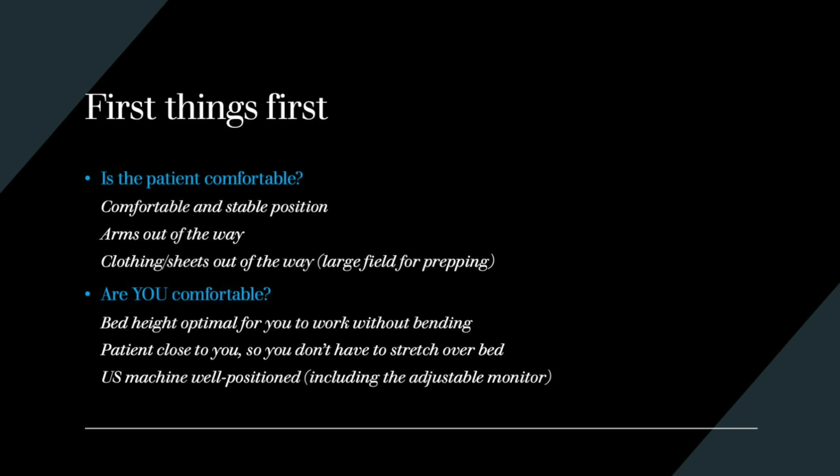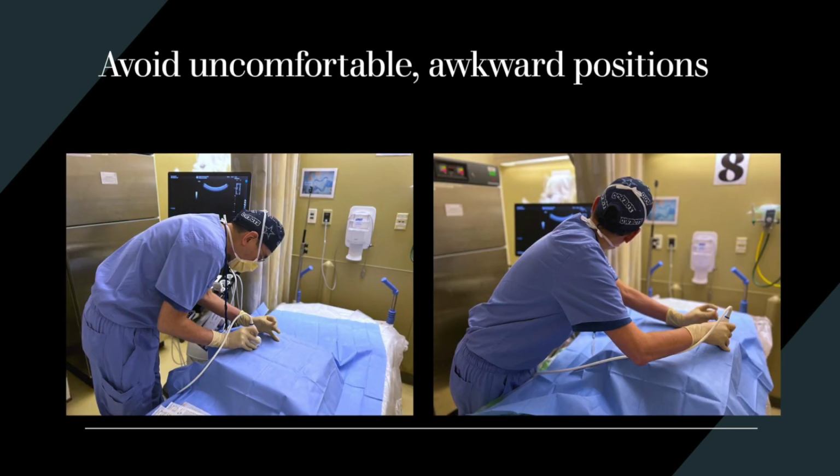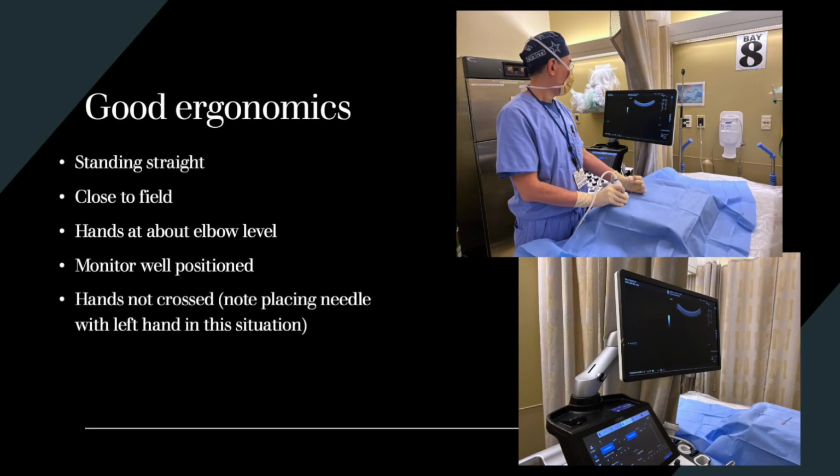Then you should ask yourself, are you comfortable? Make sure you have the bed height where the procedure is being done optimized for your height so that you can work without bending too much or without stretching yourself too much. So this is an example of a procedure being done where Paul here is definitely not very comfortable. You can see how he's bending down to be able to access the area where he's going to be performing this biopsy. And in the other example, the patient is far away from him. So he's actually stretching over the bed to get an optimal position, which is not ideal. So good ergonomics is very important.